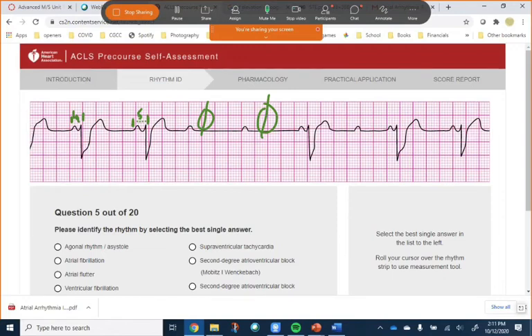That's hard when you're right in the middle of this. Let's try here to here. 1, 2, 3. We can call that about 4. And then nothing. And then 1, 2, 3, 4, 5. So we're right around 4 to 5, and I'm kind of guessing at these.